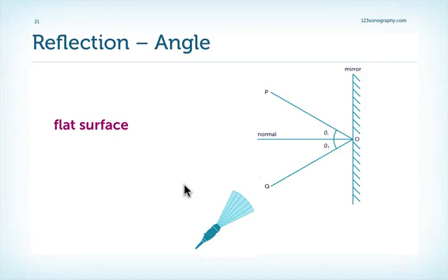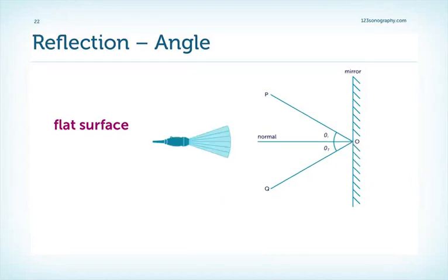So why then do we generate an image? Most of the ultrasound waves will probably hit a surface at some angle. Such a situation as you see in this diagram, where the ultrasound beam is oriented exactly perpendicular to the surface and is reflected in such a way that it is received by the transducer, is fairly uncommon.